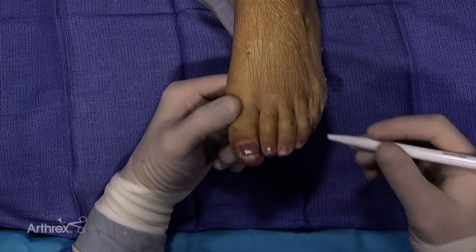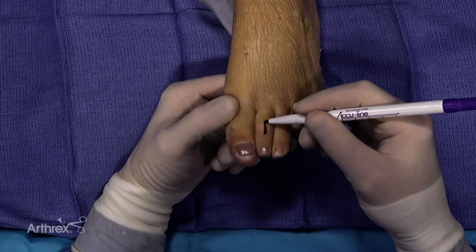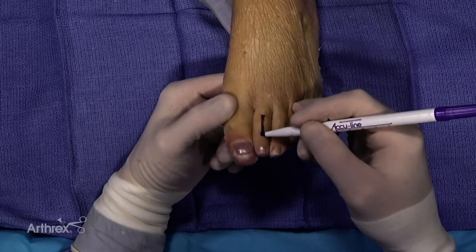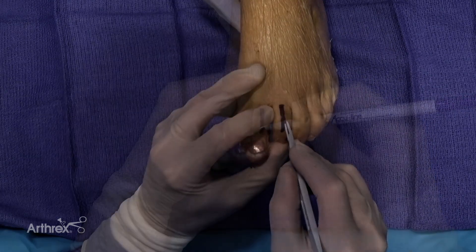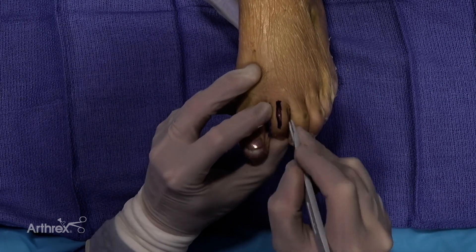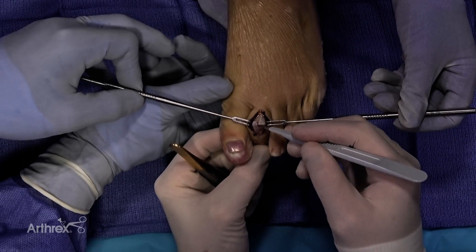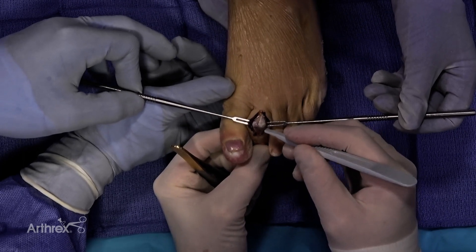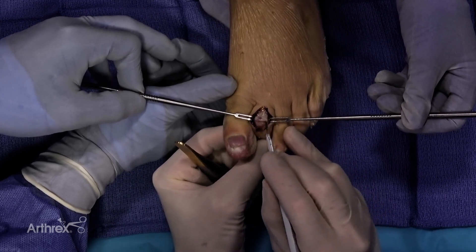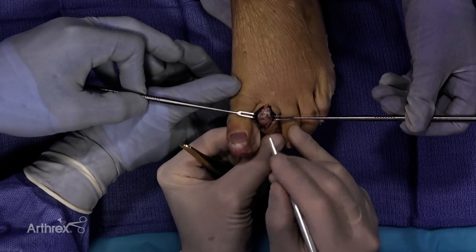Typically when addressing a second toe at the PIP, I do a longitudinal incision, and I often have to extend that to the MTP level for other pathology. For today, we'll keep this isolated to a second toe correction, so I do longitudinal, and we make an incision on the dorsal aspect longitudinally, preserving the extensor tendon underlying, and we'll close that at the end. I usually flex the toe to identify exactly where the joint is, come a little more distal as I incise through the extensor tendon apparatus, then reflect off the collateral a little bit on each side, and establish a small flap dorsally of the extensor tendon.